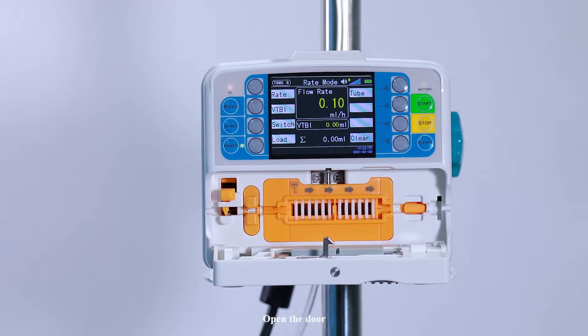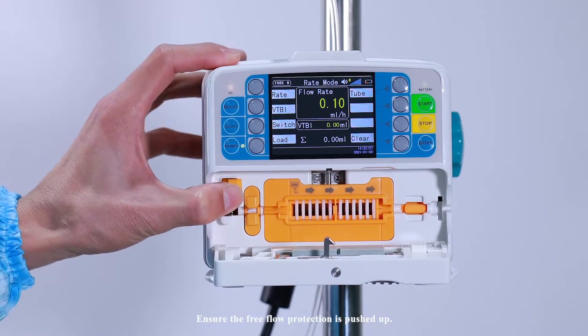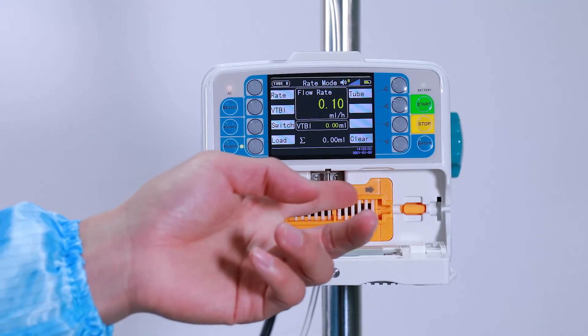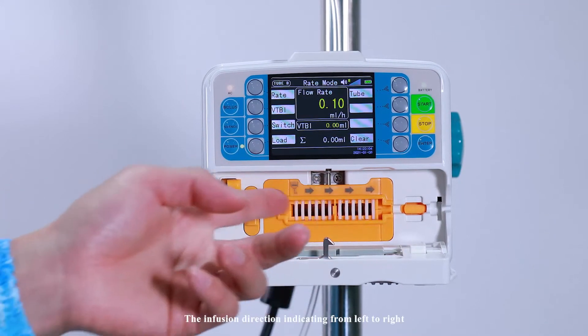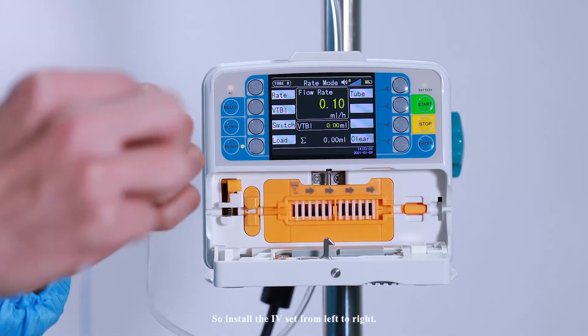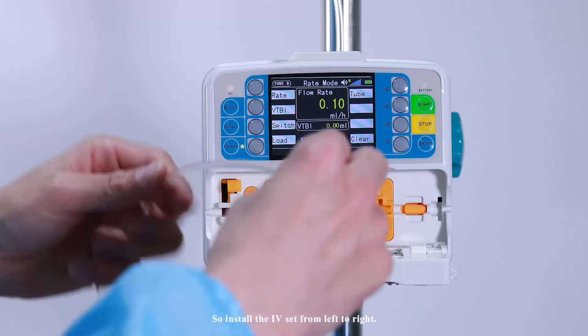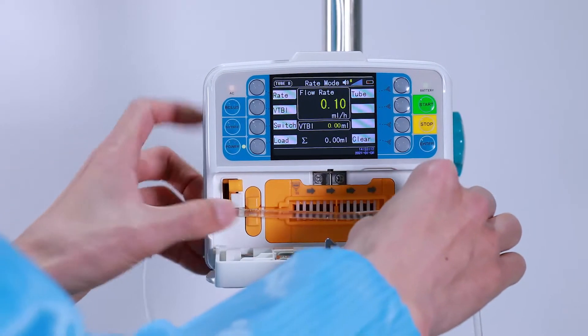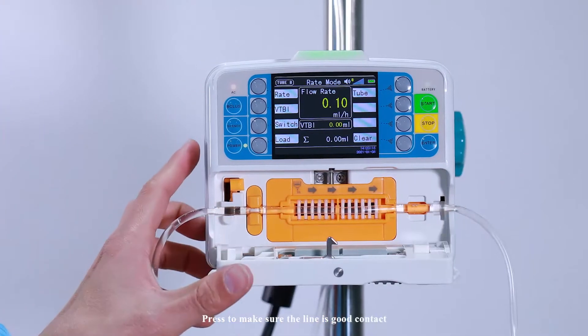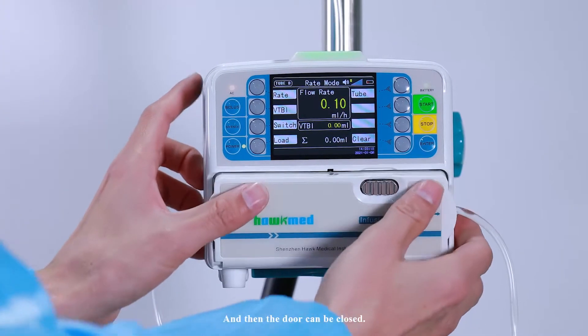Open the door. Ensure the free flow protection is pushed up. The infusion direction indicates from left to right, so install the IV set from left to right. The line should be placed smoothly. Press to make sure the line is in good contact, and then the door can be closed.